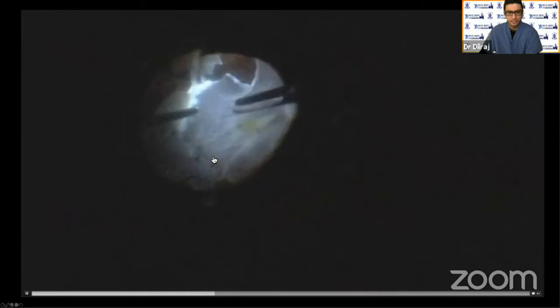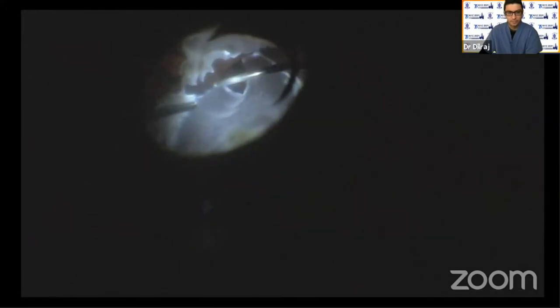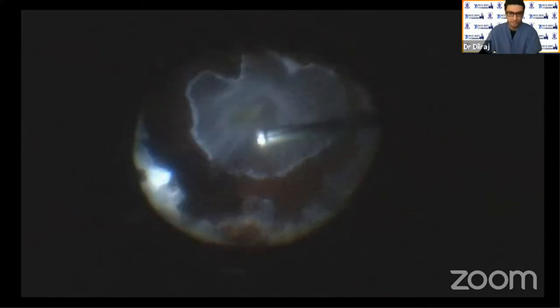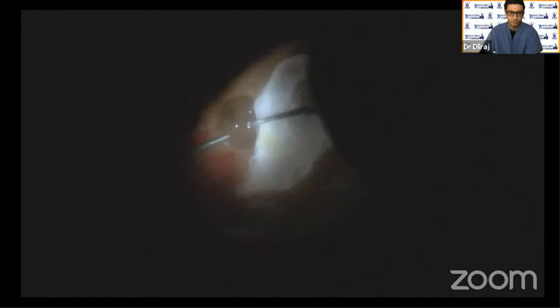Then the next step is to cut the retina. You can use scissors, but these days with our small gauge vitreous cutters, they are very effective at performing a controlled cut of the retina. And by reducing the vacuum, you can really do this in a controlled manner. This particular case had retained perfluorocarbon subretinal that was removed.